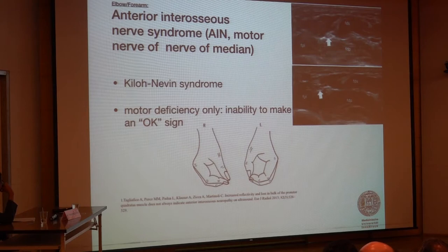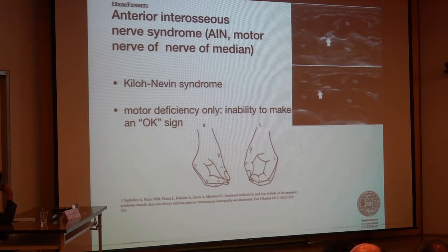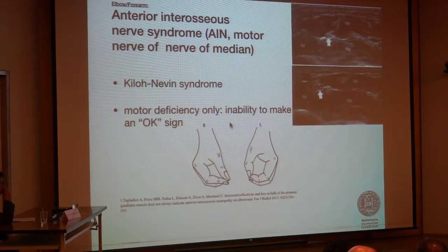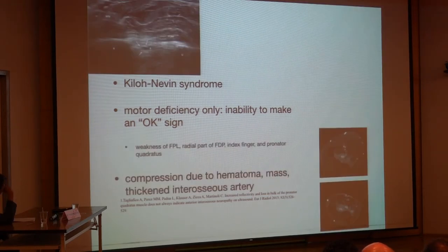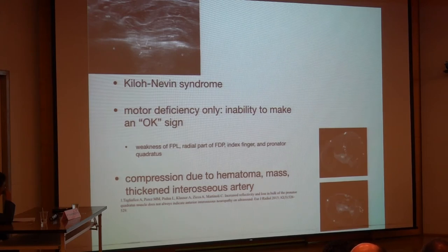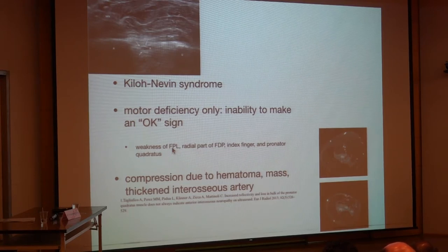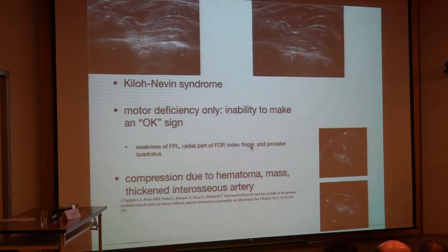The anterior interosseous nerve syndrome affects the motor branch of the median nerve and results in a motor deficiency where patients cannot make the OK sign. We can see this nerve very nicely between the deep and superficial flexors. This can result in muscle atrophy — typically of the flexor pollicis longus, the radial part of the profundus flexors of the index finger, and the pronator quadratus muscle. We can also see the close vicinity of this nerve branch to the artery.